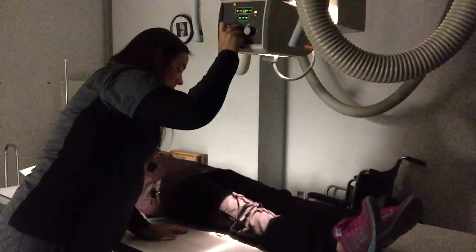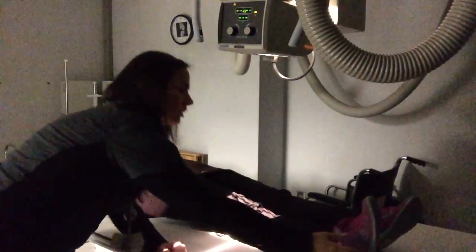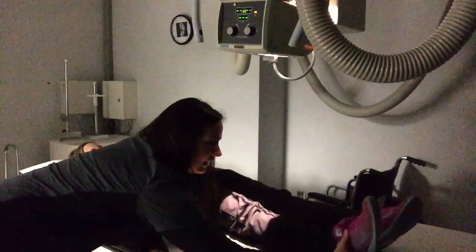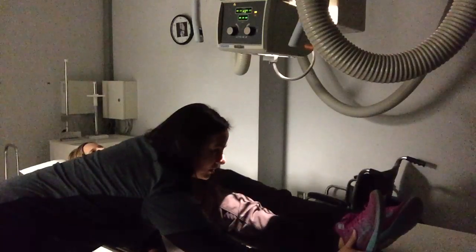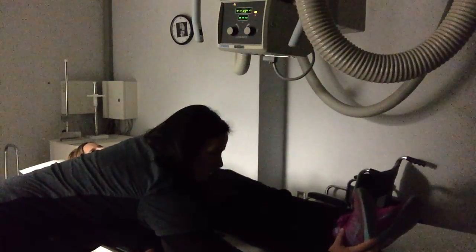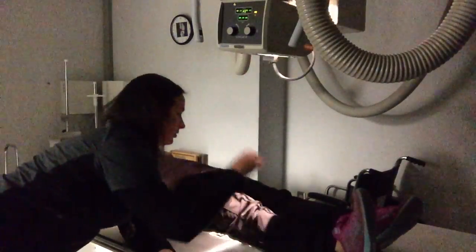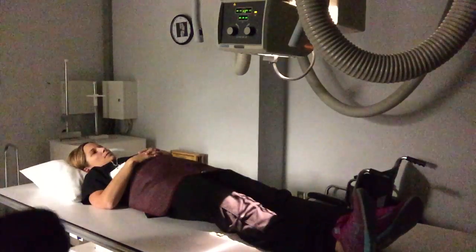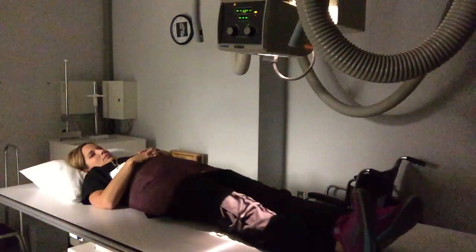Now we're going to collimate in nice and tight. And then I'm going to make sure her foot is oriented properly so that her knee is very straight. And that means I'm going to turn her toe straight up towards the ceiling. And sometimes I even have my patient pull their foot back to make sure they're holding that position for me throughout the exam. Alright, looks pretty good. So I am going to expose this at 85 kVp.